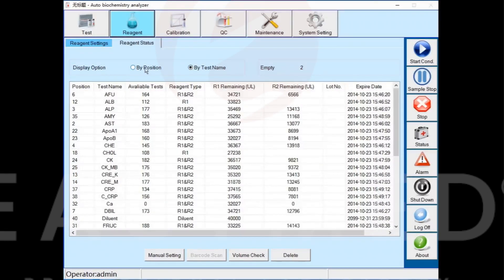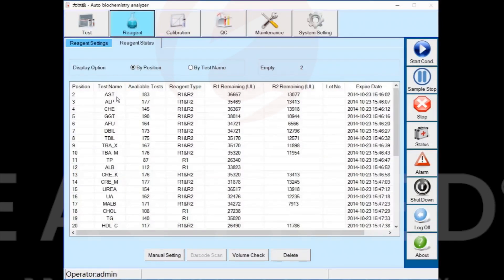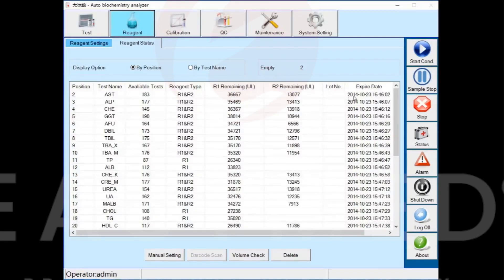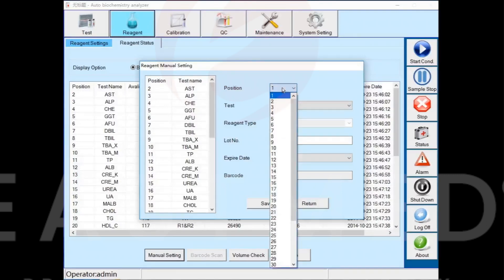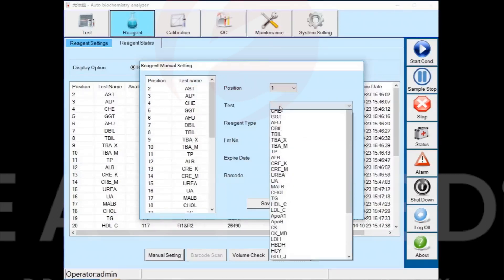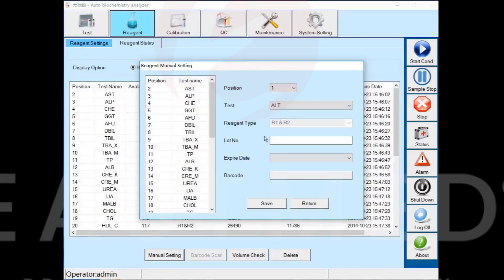You can view the corresponding reagent type, and the software can count the remaining tests amount and expiration date. Clicking the manual setting button, you can add a new reagent position. Select an unoccupied position, select the desired test item, select the validity date of the reagent, and click the save button to save.